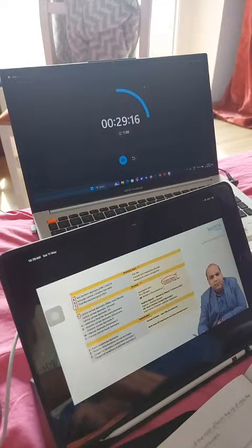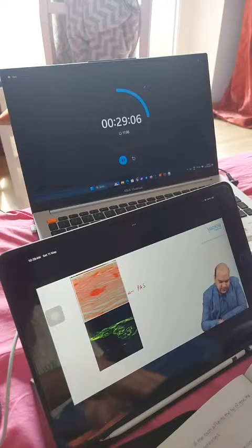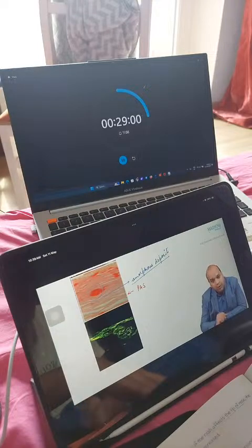Now how do we see amyloid? We can either see it by PAS stain or we can see it by the Congo red stain. So let's see, everybody. This is a photograph which has been given to you. This is obviously which stain, everybody? Periodic acid Schiff stain. You can see an amorphous pink deposit here. Yes, this denotes amyloid. Or the better diagnosis is by Congo red stain.